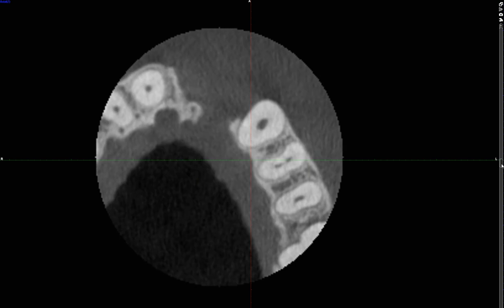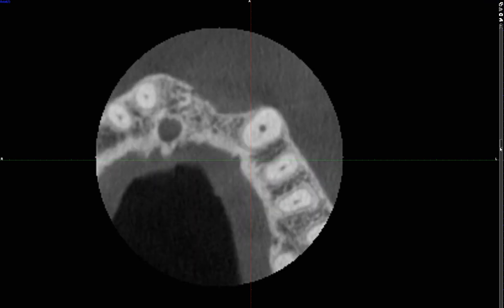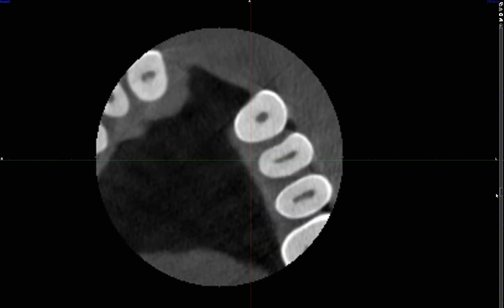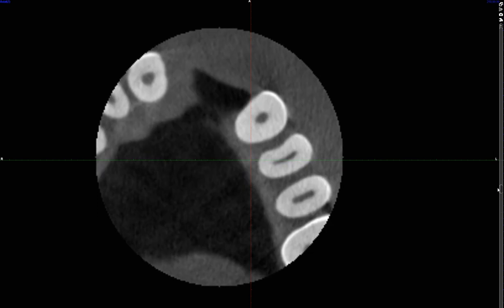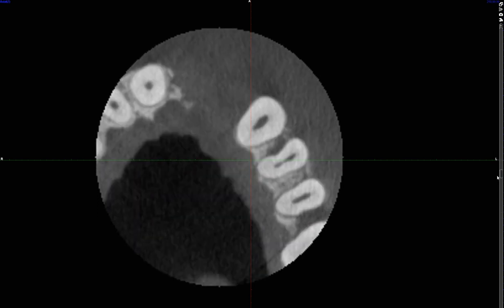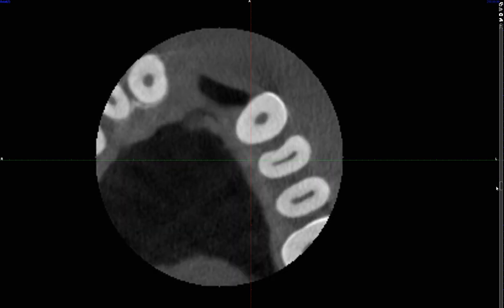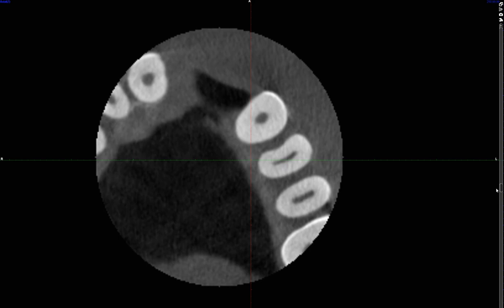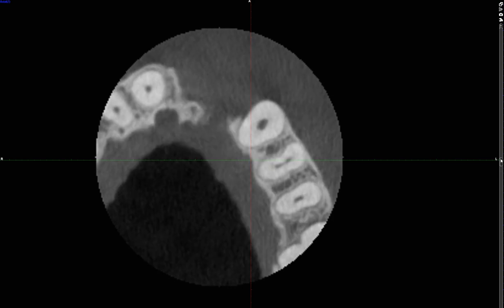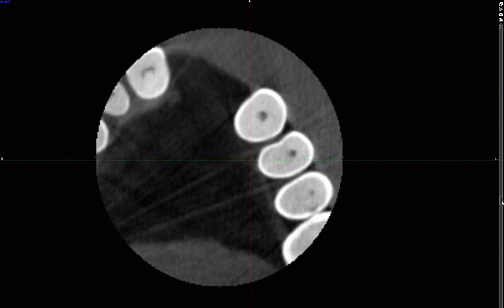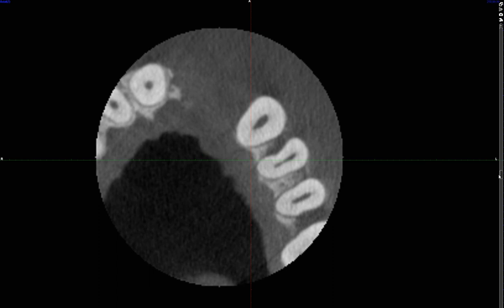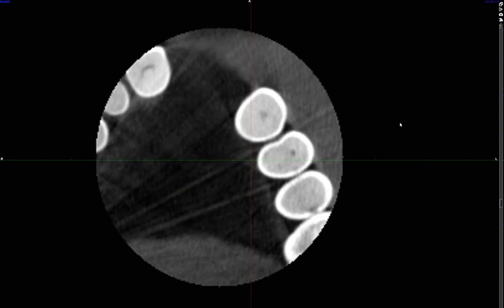Another question I asked was: where can you find the proximal caries? We're going to focus on the maxillary teeth for now. Ask yourself which tooth clearly demonstrates proximal caries. If you're D3 or D4, by now you should feel comfortable detecting proximal caries on bitewing radiograph, but you have not yet seen caries on cone beam CT. So this is a great example. Let me zoom out and rotate the volume to create a corrected sagittal view.